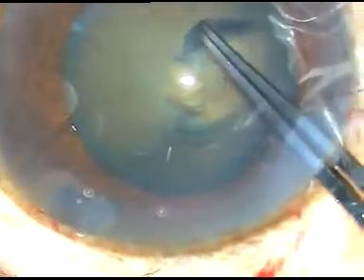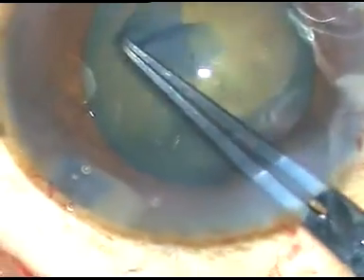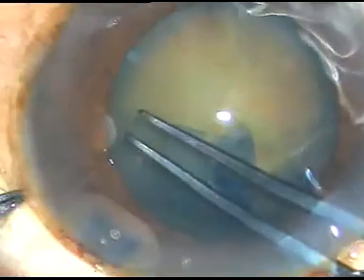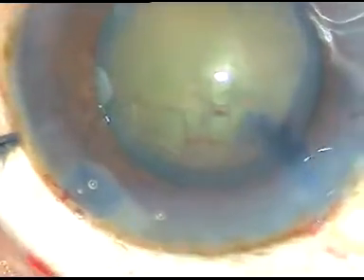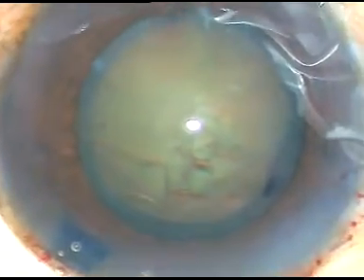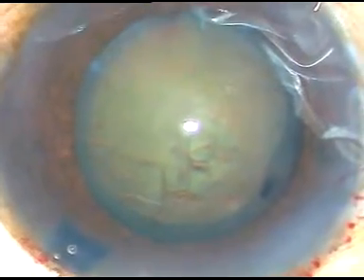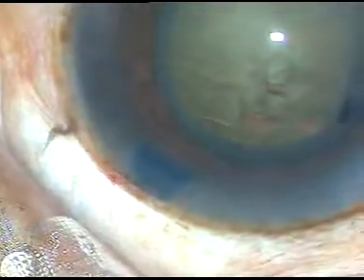The flap is held with the Utrata forceps and it is guided anticlockwise. There is no need of Rhexis marker. The pupil itself guides very well as a Rhexis marker, as a guide for Rhexis. You have to be at an equal distance from the Rhexis margin all around, and you will do a very nice continuous curvilinear capsular Rhexis.